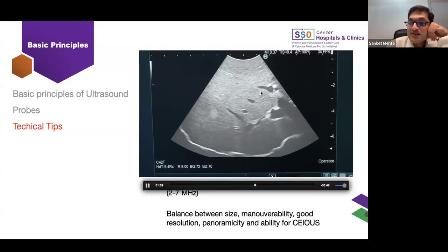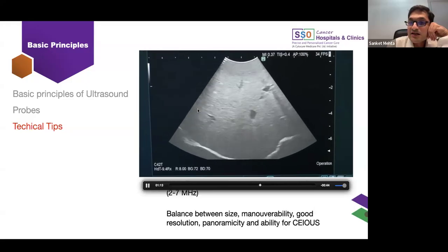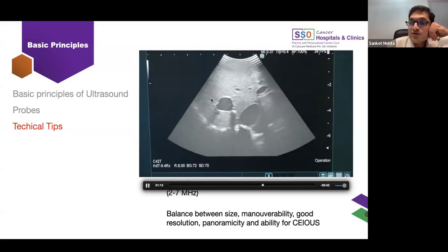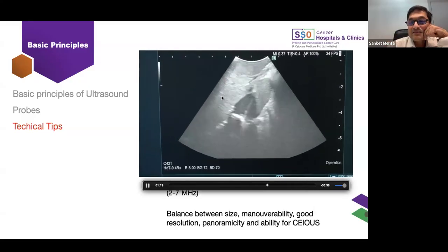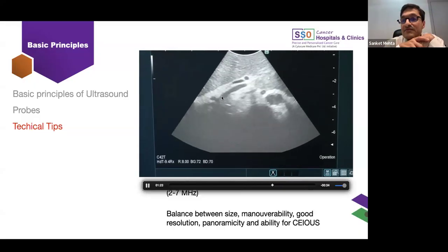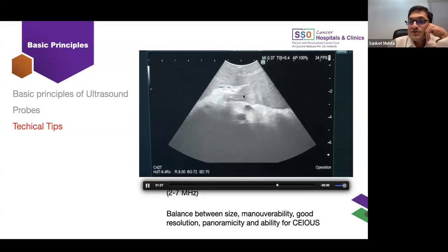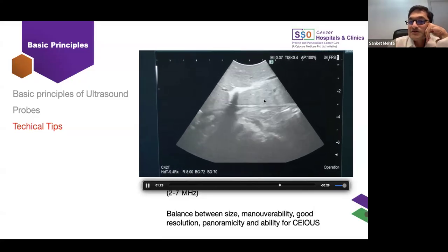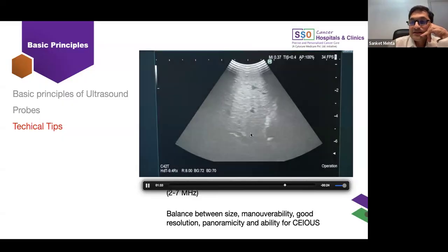Now, if you follow this vein, the right hepatic vein, as it goes, it is between the anterior and posterior sectoral pedicle, which helps us identify exactly, for example, now we can see as it goes back, the lesion which is there, and you can use that to segment the liver and to find out in which segment the lesion is located and how to approach this. You can also see this is a segment 2 lesion, which was below the segment 2 portal Glisonian pedicle out there.